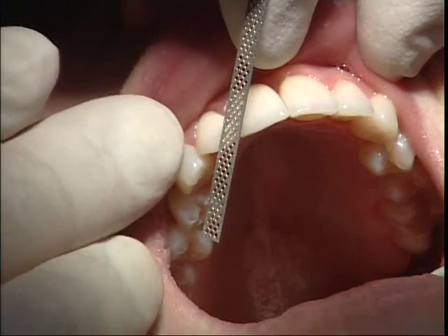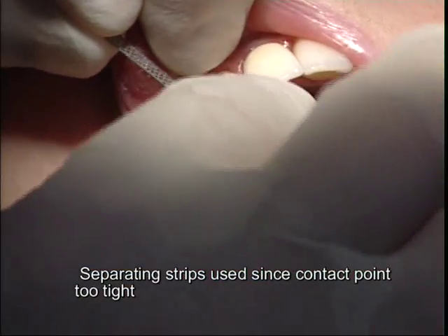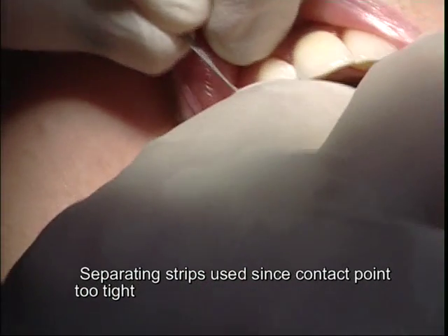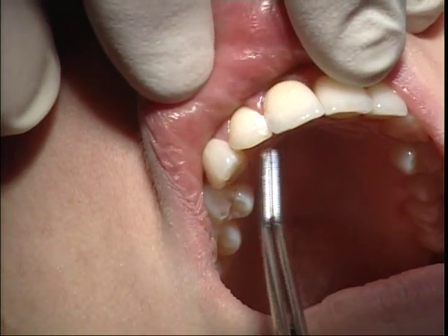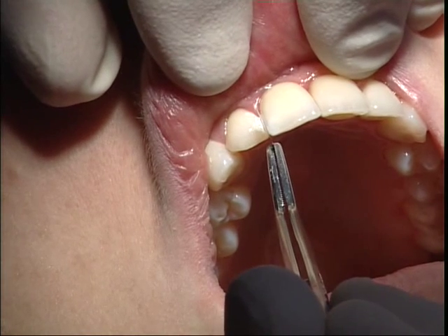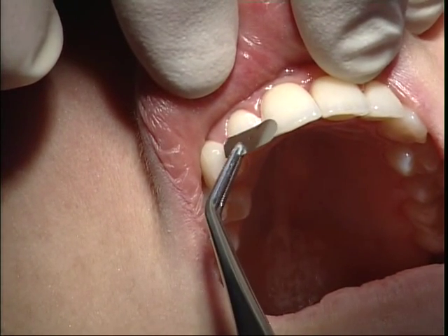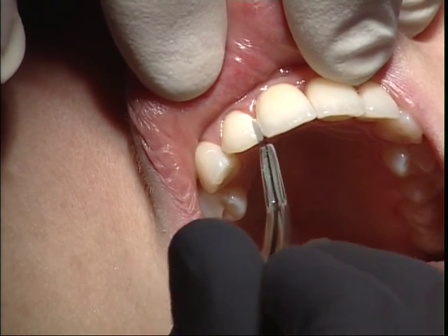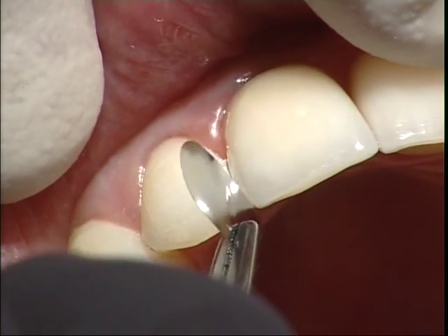It is a little bit too tight. I need a matrix in there when I am taking my impression. So we are using a separating strip since the contact point is too tight. The matrix I am using later during impression taking is to help my lab technician — to make it easier to separate the dies in the master model. This is a matrix that we just cut from a normal filling matrix. I will do two holes in it, one on each side, so that it will be better retained in the Impregram impression material later. We should help our lab technicians more than we believe and as often as possible.